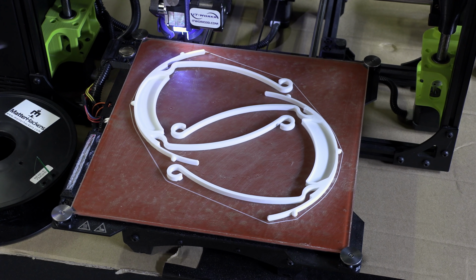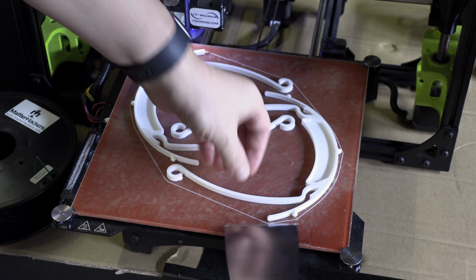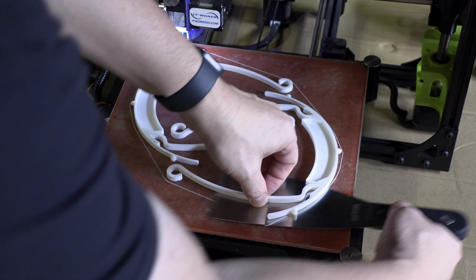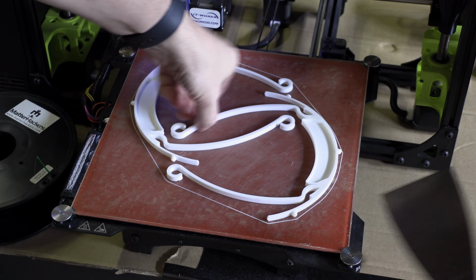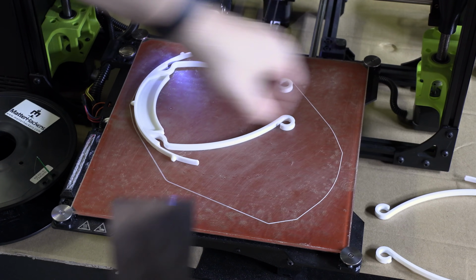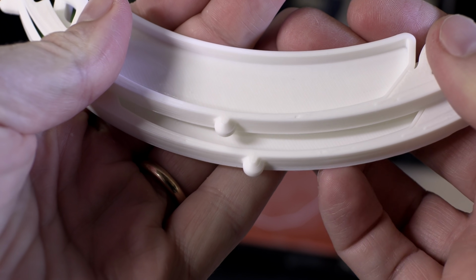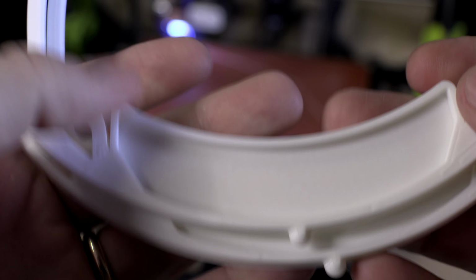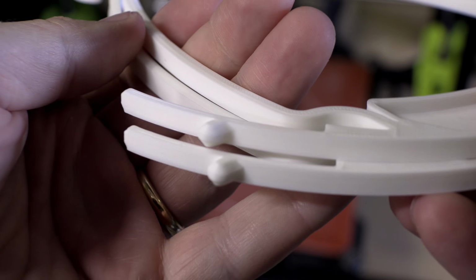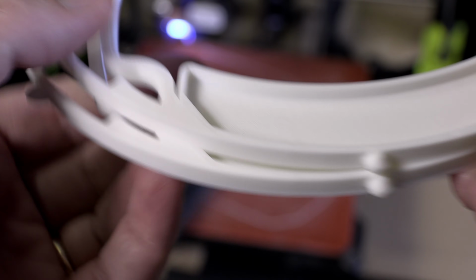The TAZ 6 looks done, and I have this. This is from Zortrax. It's a big scrapey thing. So I can kind of free off a piece there and then kind of get it under, and then things start to pop up and they pop off the PEI. Okay, there's one and two. These have a tiny little bit of an elephant's foot right there, so that can be scraped off pretty darn easily. The rest of the extrusions look fantastic. This is Creality PLA, and it prints great. Look at that. These are fantastic.